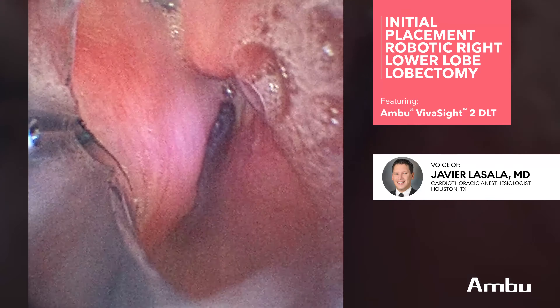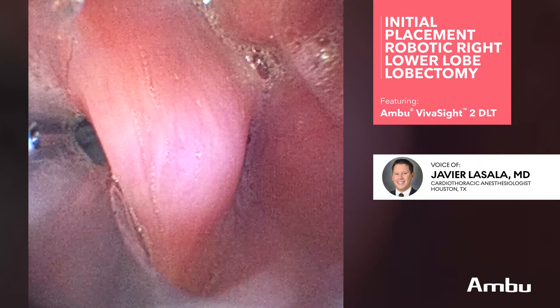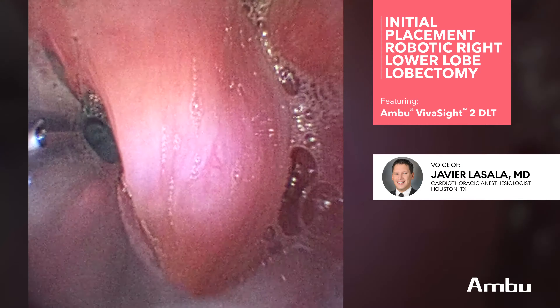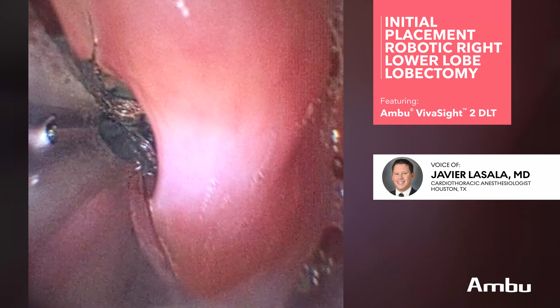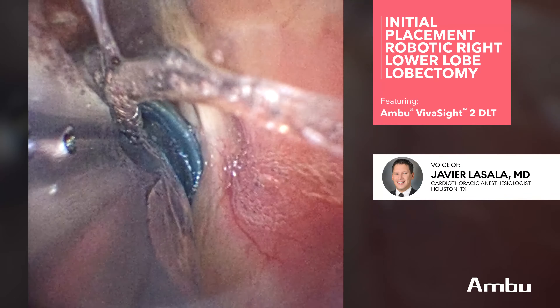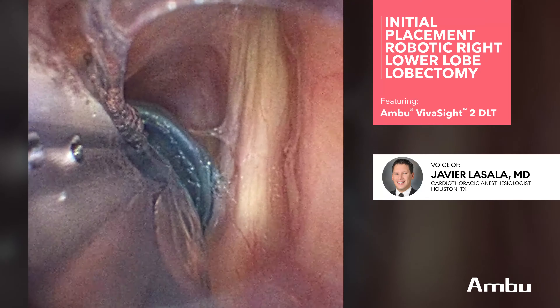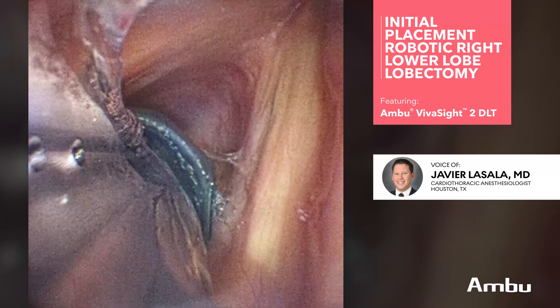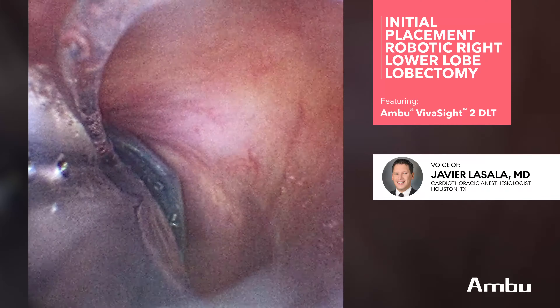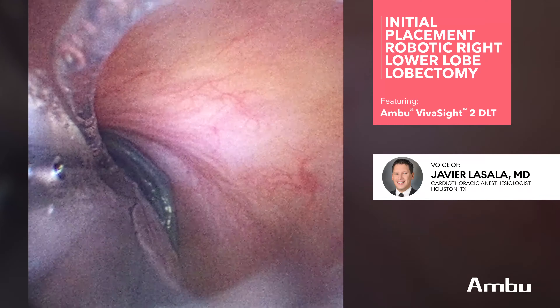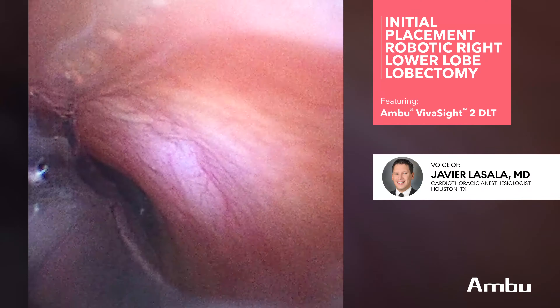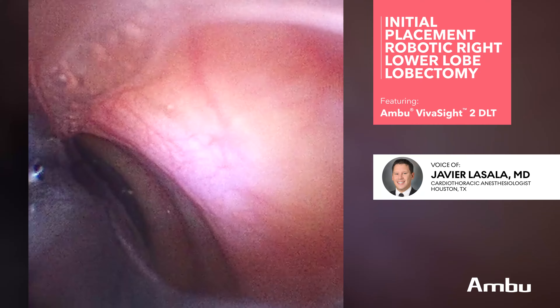We work our way very slowly to avoid the camera from hitting mucosa or secretions so we can continue having a clear video view. As we pass the vocal cords, we slowly move the camera to the left 90 degrees from 3 o'clock to 12 o'clock. We pass the vocal cords at 12 o'clock.